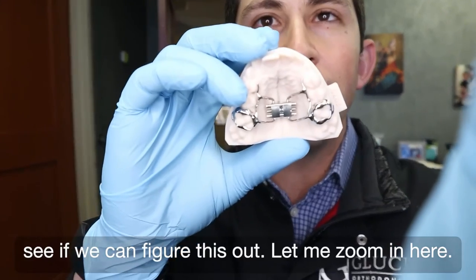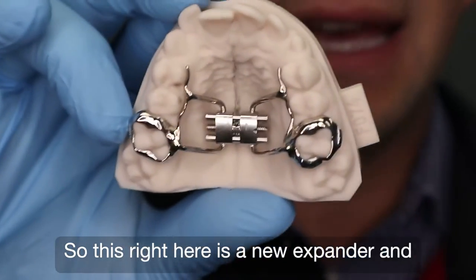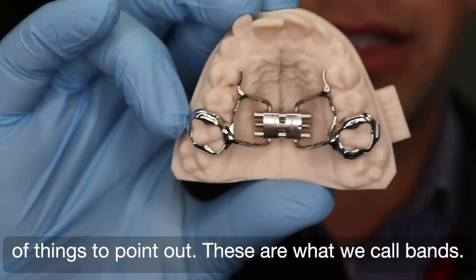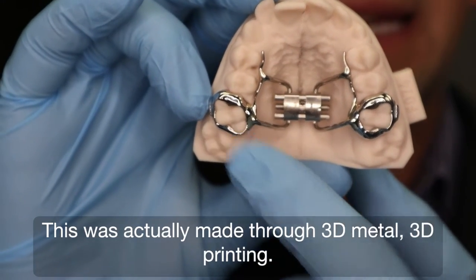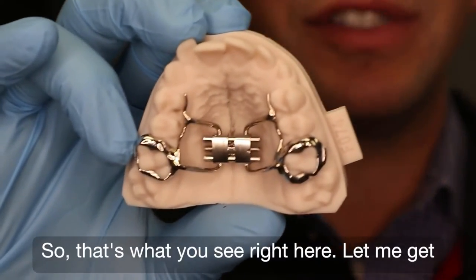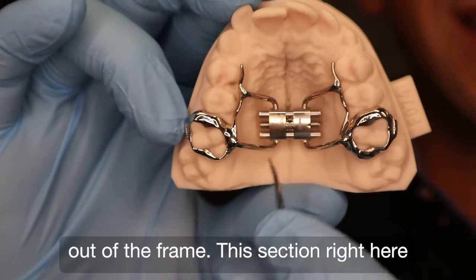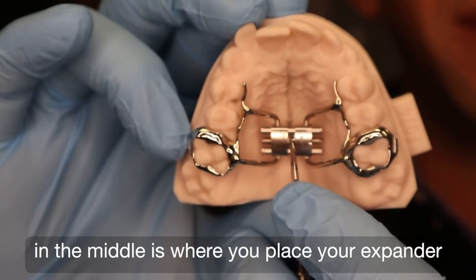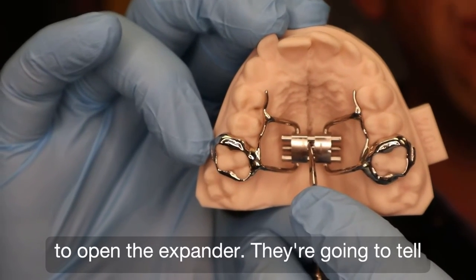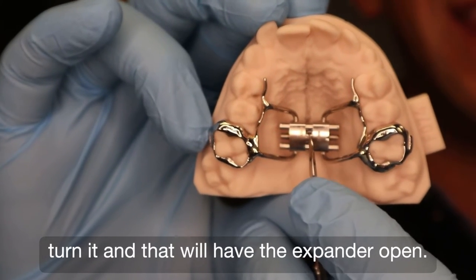Let me zoom in here. So this right here is a new expander and it's on a patient's model. Obviously it's fitting over the top teeth. A couple of things to point out — these are what we call bands. This was actually made through 3D metal printing. This section right here in the middle is where you place your expander key when you do your turns. So when you go into the orthodontist, they talk to you about how to open the expander — they're going to tell you, put your key in this little hole and then turn it and that will have the expander open.